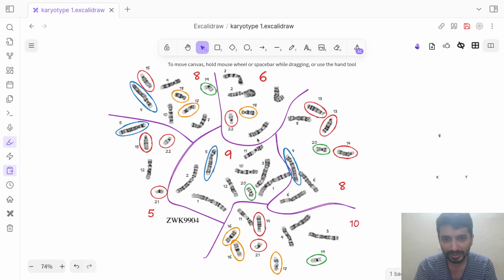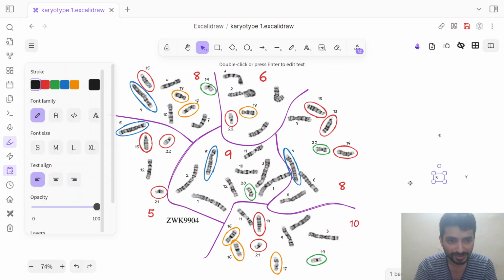Again, they are somewhat like shoulder bands, and they are equidistantly placed from the centromere, giving the appearance of a bikini. And actually these are called the bikini bands, and you can see them over here as well. So our hunch was right, this is a female karyotype, and we get one X here and one X here.